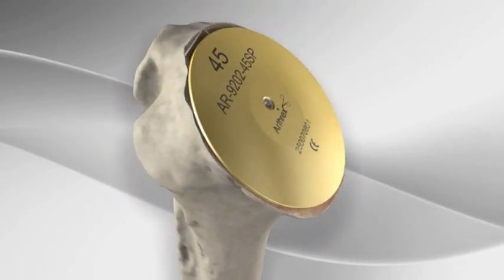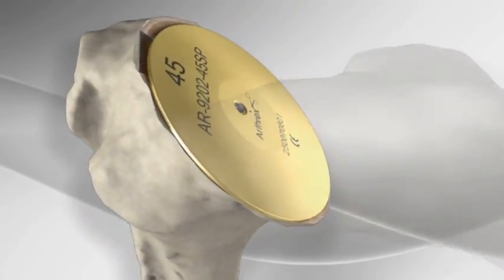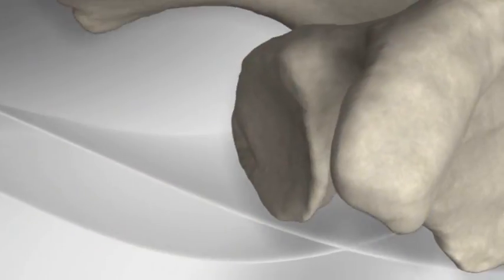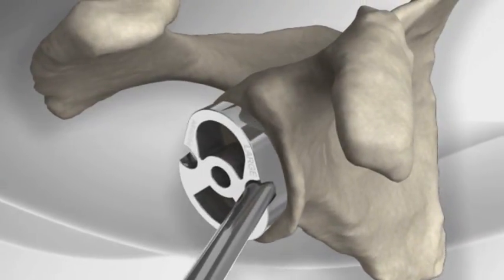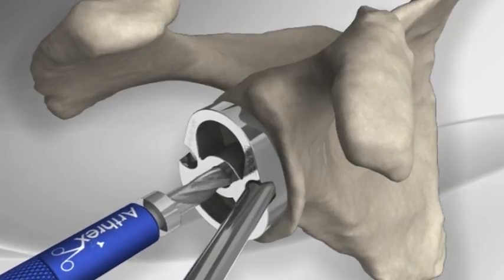A trial prosthesis is inserted and the surgeon then turns his attention to the glenoid. A drill guide is centered on the glenoid and a hole is drilled through the guide.